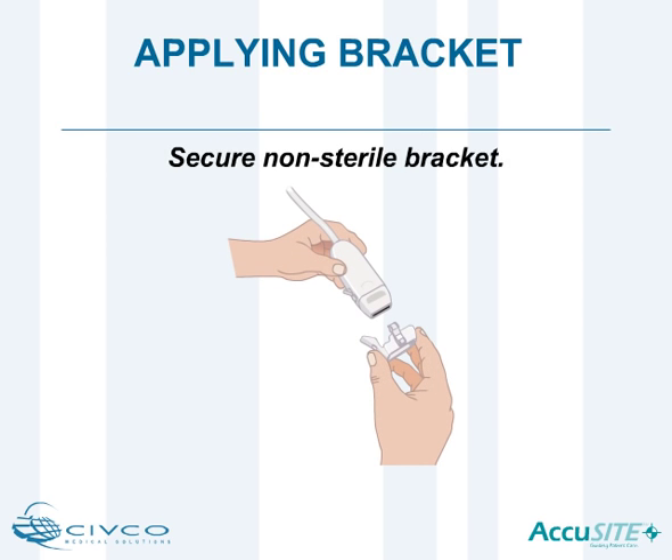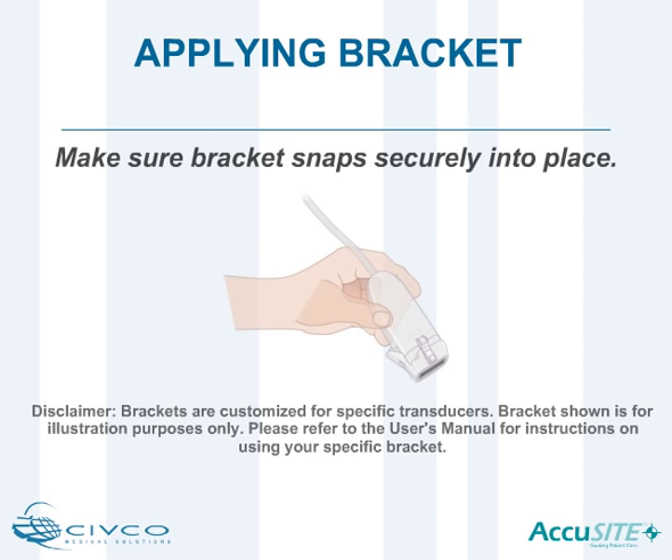Before opening the sterile disposable procedure kit, place the reusable bracket onto the transducer. The bracket should snap securely into place according to the corresponding locating features on the transducer.